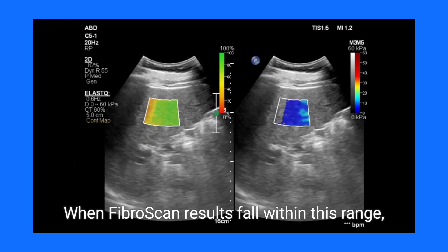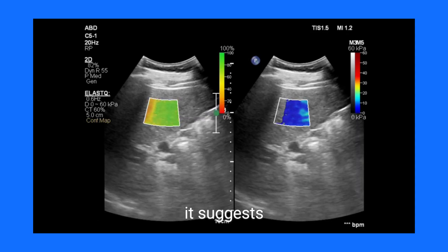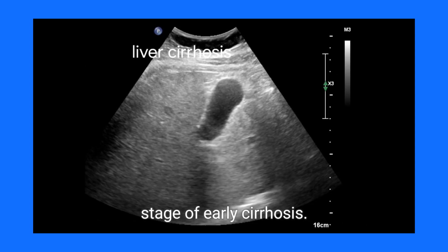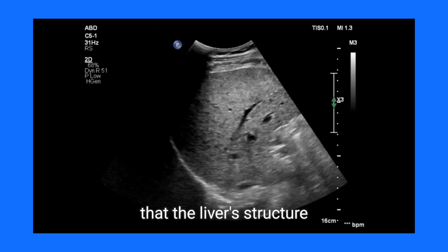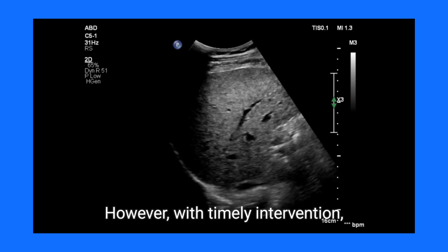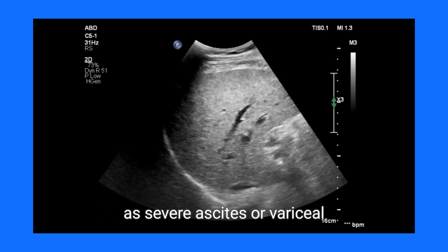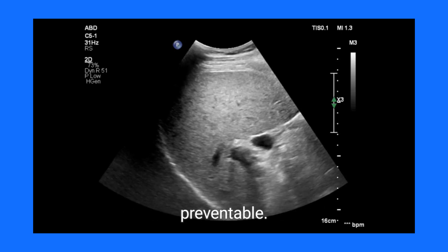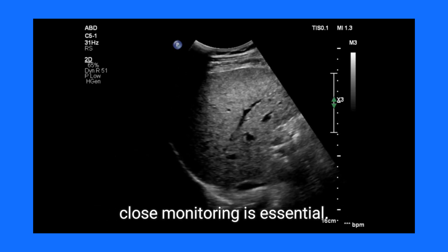The clinical significance of these findings cannot be overlooked. When FibroScan results fall within this range, combined with the ultrasound findings, it suggests that the liver is in a critical stage of early cirrhosis. This stage is crucial because it indicates that the liver's structure and function are beginning to deteriorate. However, with timely intervention, complications such as severe ascites or variceal bleeding may still be preventable.